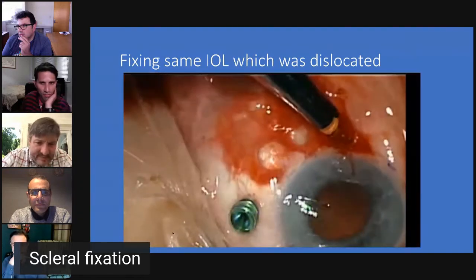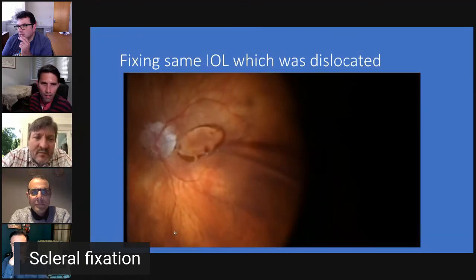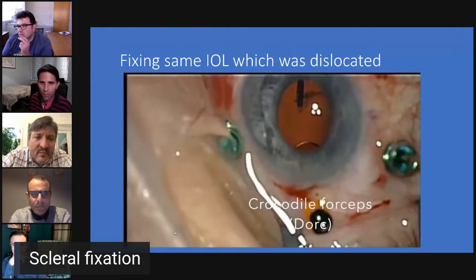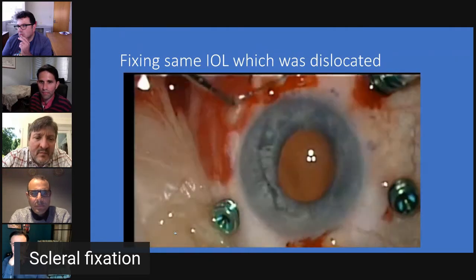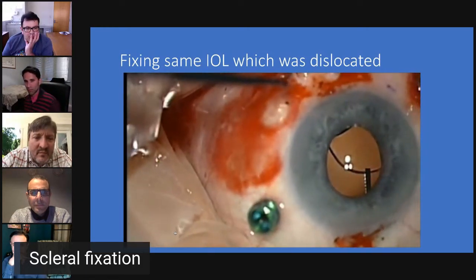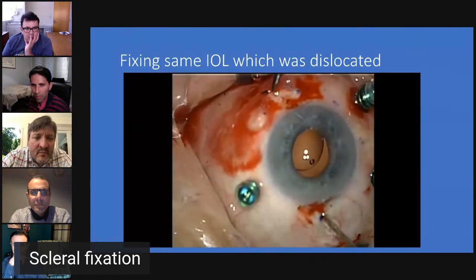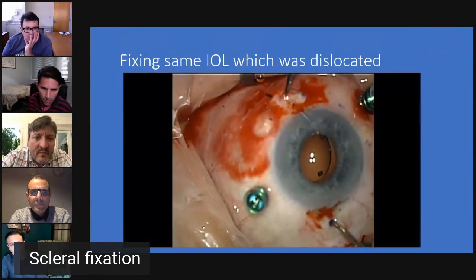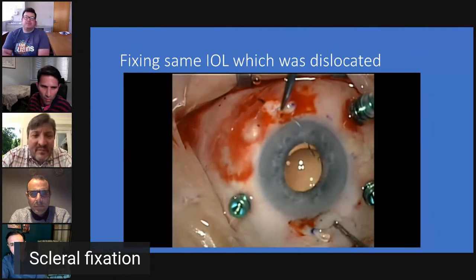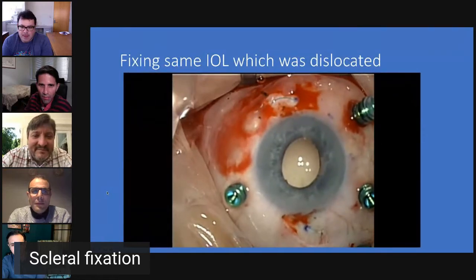So a similar sort of process of making some tunnels. In this case, I used valveless ports to help grab the IOL and then feed them through with crocodile forceps, which are serrated forceps, through the sclerotomies that I made. And again, sort of a handshaking technique to help grab the tip of the haptic out. And this guy, therefore, we were able to use the same IOLs that he came with, but put them back into the position that allowed him to see.